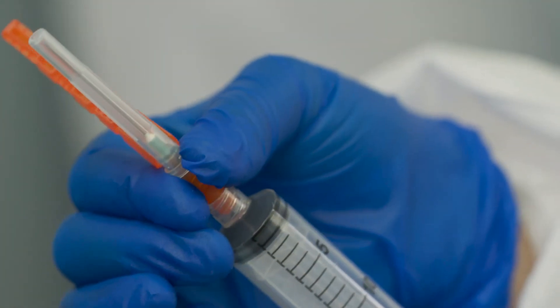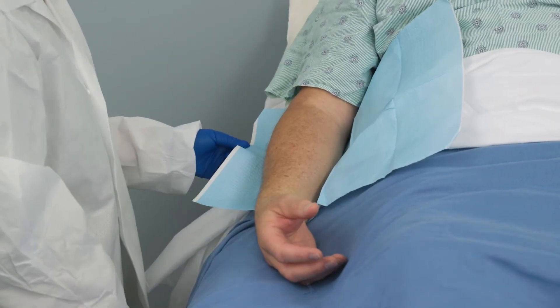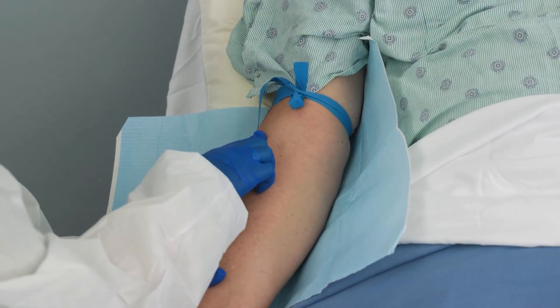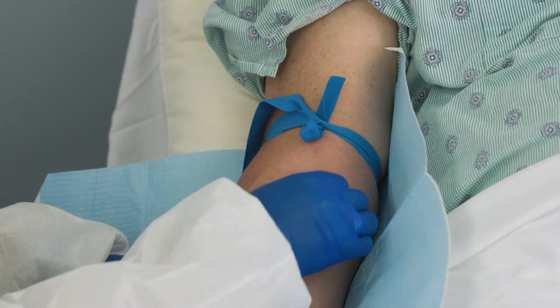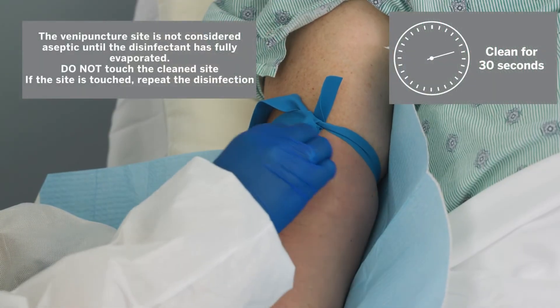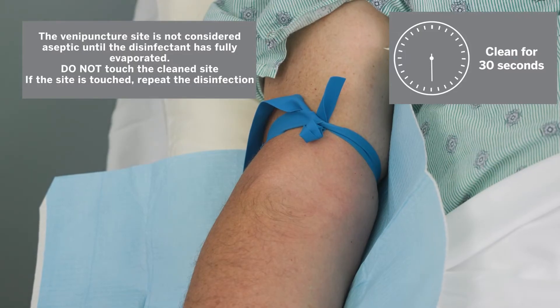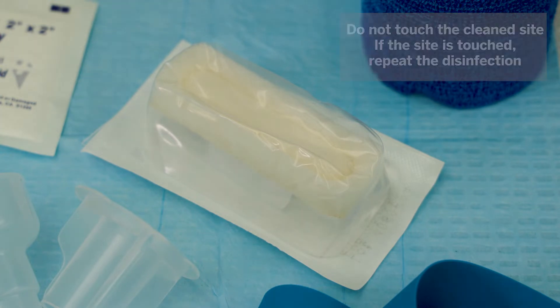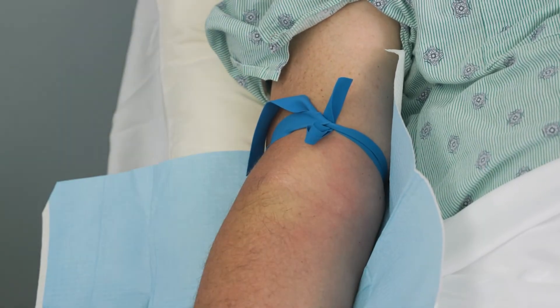Assemble the syringe and needle. The arm is the recommended site for drawing a blood culture. Place a disposable underpad under the patient's arm. Locate the vein and apply a disposable tourniquet, then palpate to locate the vein. Disinfect the chosen venipuncture site according to your facility's approved procedure. Recommendations are to cleanse the site with friction for 30 seconds using 70% isopropyl alcohol. Allow to dry, then apply the second disinfectant following the manufacturer's recommendation. The venipuncture site is not considered aseptic until the disinfectant has fully evaporated.